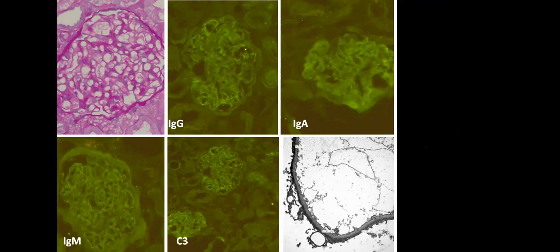Because many times when we label a case as minimal change disease, a call will come that despite giving steroid, there is no response. This is like steroid resistant. So kindly have a relook at this case, to see if there is any segmental sclerosis lesion. But I'm telling you that the more the number of glomeruli, the more the chances of picking up the segmental lesion. So I always write normal glomerular morphology, and I will say the morphological possibility is to consider minimal change disease or unsampled FSGS and correlate with the steroid response.